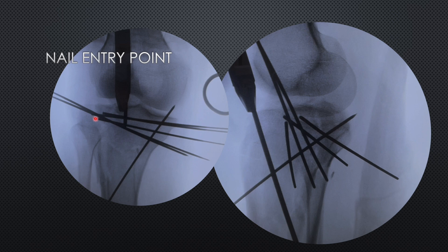Multiple K-wires have been placed and exchanged with new K-wires so that the wires do not block the area for the plate and the nail. In lateral view, you must ensure that all wires placed to reduce the depression are in a zone posterior to the nail entry point. The entry point will come at the junction of the articular surface and the anterior margin of the tibia. The wires should not enter this zone, otherwise they will hinder the nailing process.